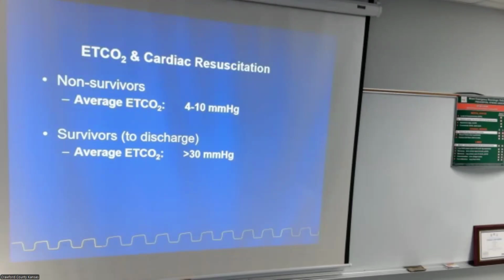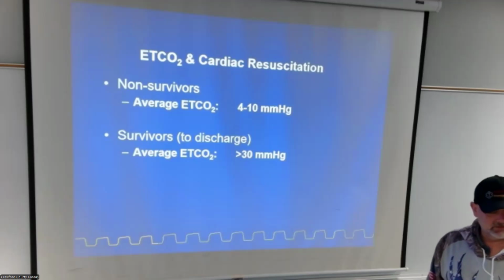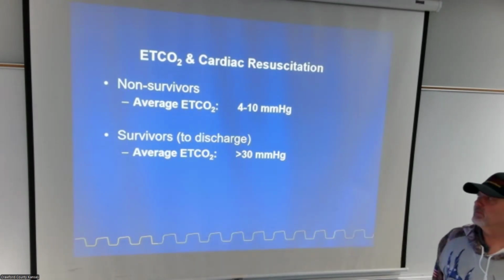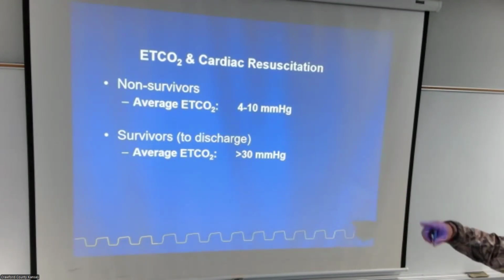And this is something that I do a lot: you intubate your patient, you get your CO2 reading, and it says it's between 4 and 10. That patient is not going to come back. If you can do your rounds of CPR and you can average anywhere from 25 up into the 30s or above 30, you have a good chance of survival. This is where I'm a firm believer you should intubate your codes, all your codes, regardless if you're going to transport or not, because I want to know what that end-tidal is.